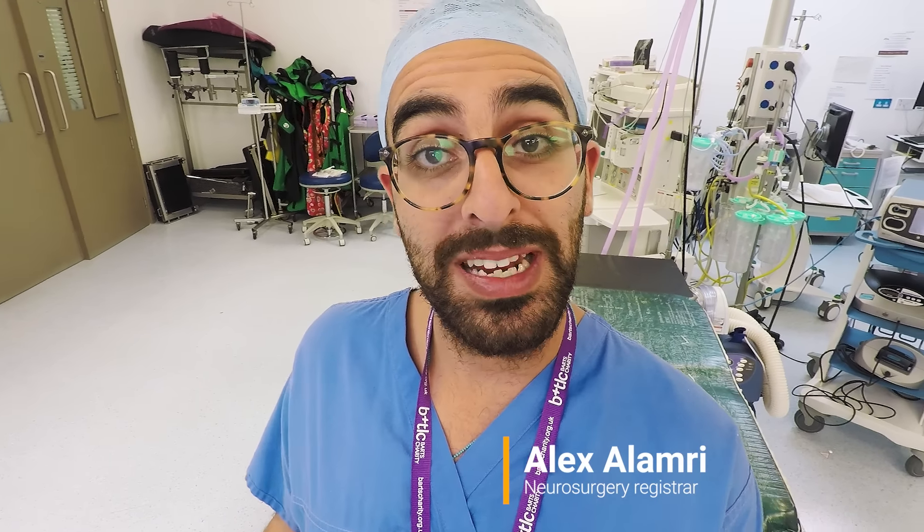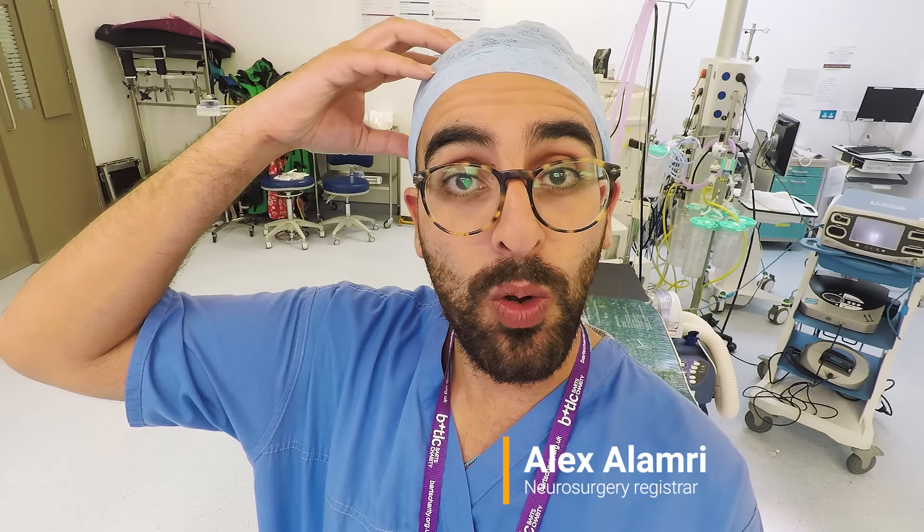Today I'm going to take you through how we do a craniotomy — that's making a hole or a flap in the skull and taking that bit of skull off so we can access the brain underneath.